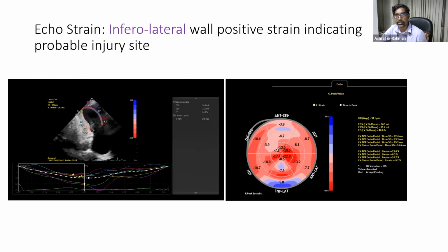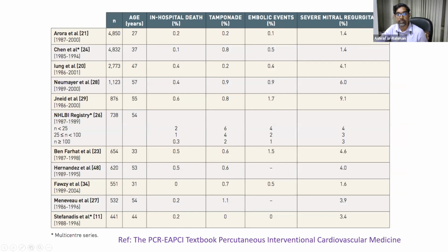So we identified the possible cause: there was pericardial tamponade. We did the CPR, and we continued the autotransfusion that saved the patient's life after a successful PTMC. So these are the complications of PTMC.